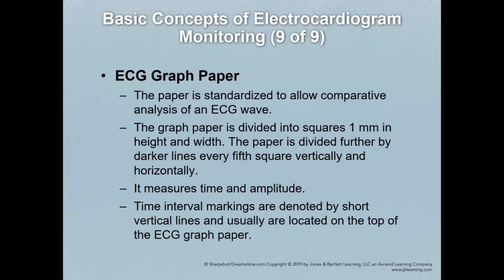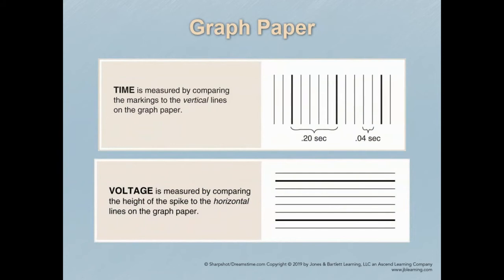The reason being is because we're looking at time as it travels out, and we'll get our measurements for that in just a second. So we're measuring time as our EKG paper comes out, and we measure height or amplitude, which determines how much voltage there is. So that's why when we talk about P waves in a moment, they're small because our atria are small, but then we have a QRS complex for our ventricles, and it's much bigger because they're much bigger. So that's what I mean when I say we'll be looking at voltage.